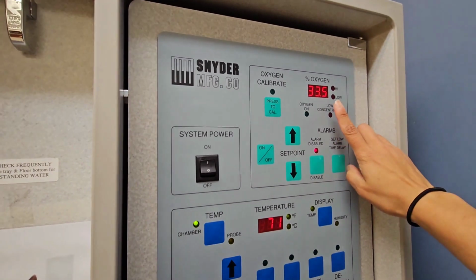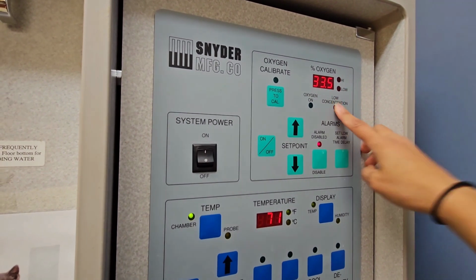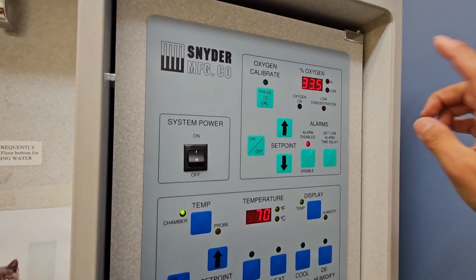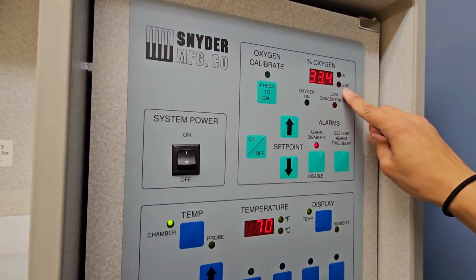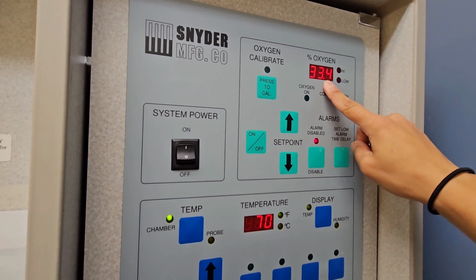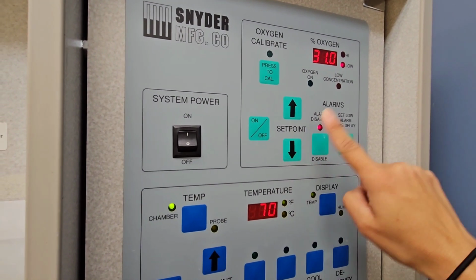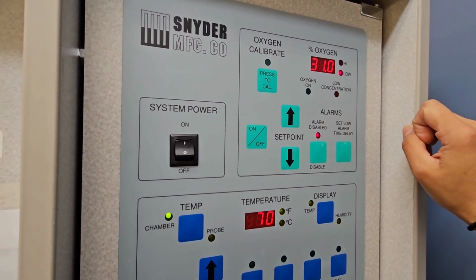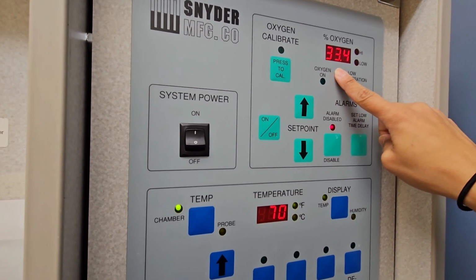All right, now you can see that our machine is fully calibrated now that we are up to at least 33%. And the high level of percent oxygen and the low level will always be 2% apart. So if the high is 33, the low will be 31. And I can check that by just hitting the down arrow. It tells me that it's 31. And then it'll take a minute, and then it'll go back to showing me the current level of oxygen.